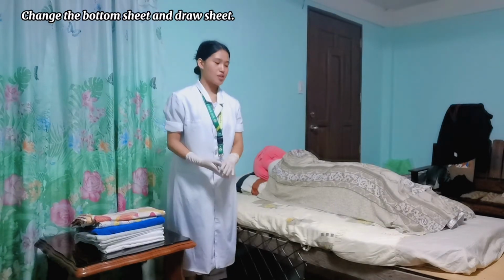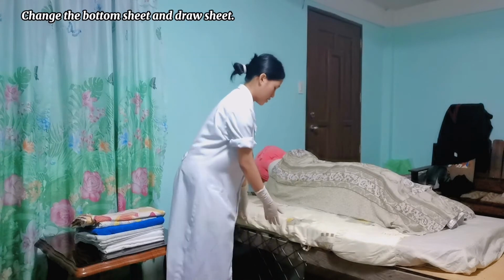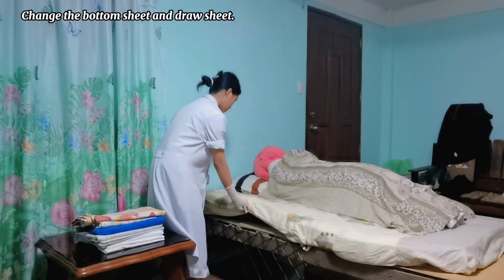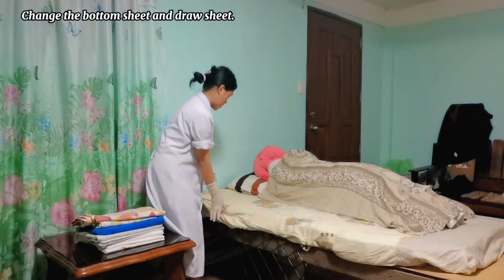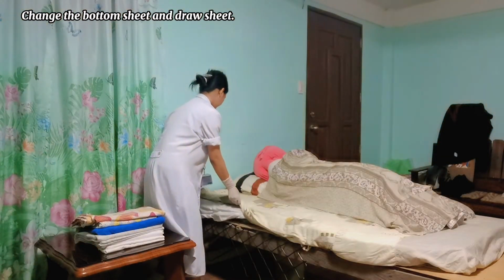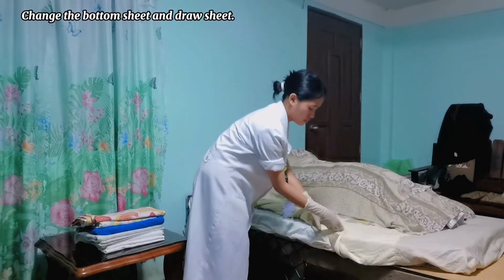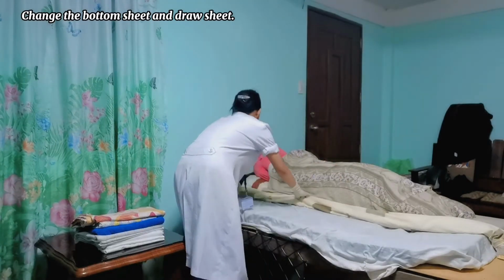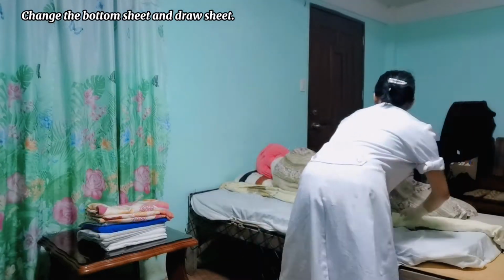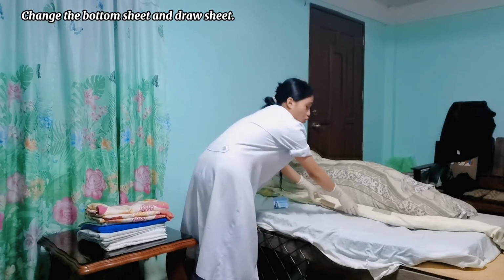And then the next one is we are going to loosen the bottom sheet inwards, opposite to the patient. Make sure to tuck it as close as possible to the patient.